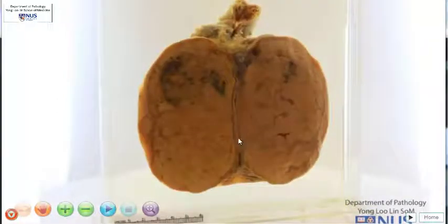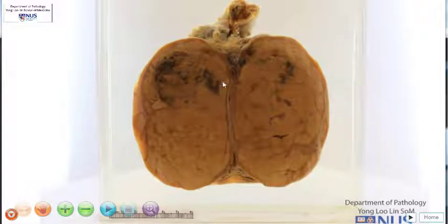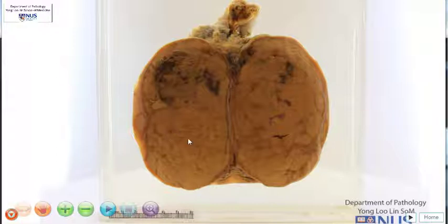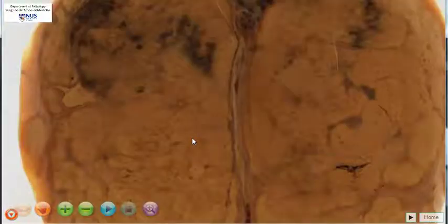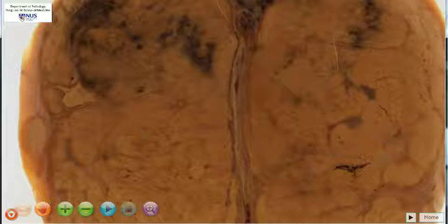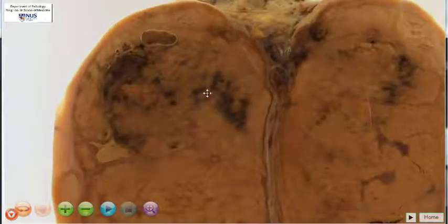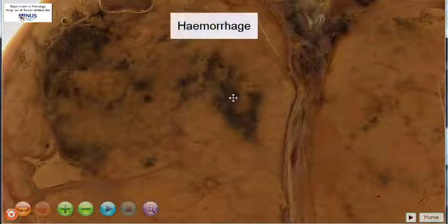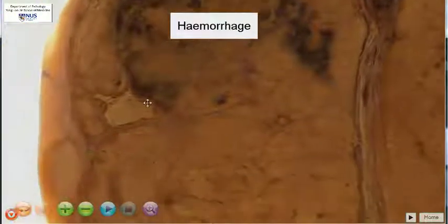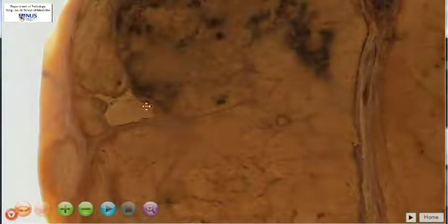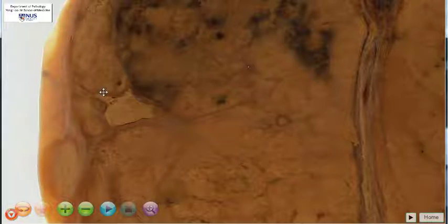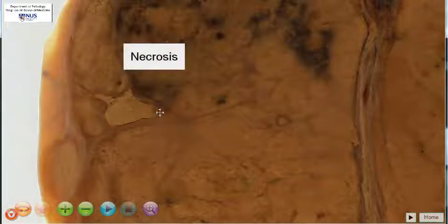Let's look at the cut surface of the testis. What we can see entirely replacing the testicular parenchyma is a fleshy, tan, brownish, lobulated tumour mass. There are areas over here that are darker, and these indicate the presence of hemorrhage. And if we look over here at this pale, quite well-defined geographic area, this indicates necrosis.